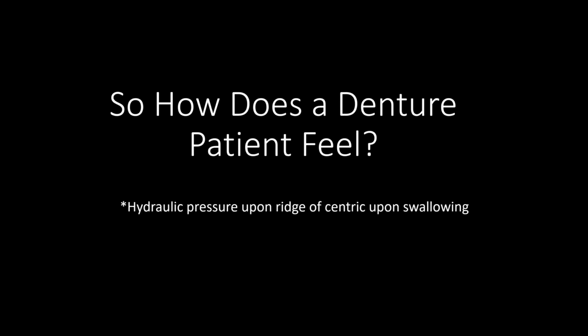And we forget that. So how does a denture patient feel? Well, number one, they're going to feel hydraulic pressure. So they feel the pressure of the denture pushing against the ridge. When you touch your teeth together in centric, there's a certain amount of pressure applied, and that patient feels that pressure. So then they know when they swallow, they feel their teeth touch.